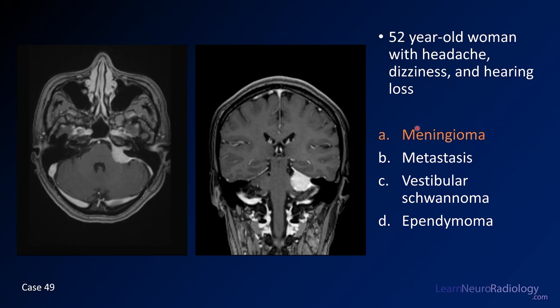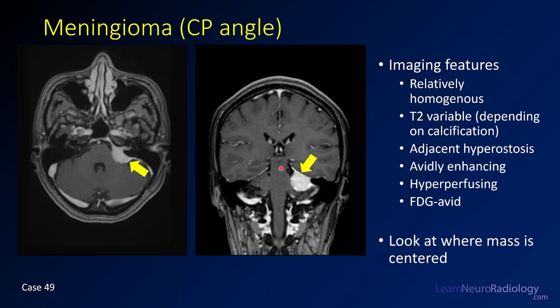This is a case of a meningioma. The mass looks centered along the tentorium or dura — it may extend into the IAC a little, but doesn't expand it and doesn't look centered there. The key rule: a CP angle mass that enhances is a schwannoma or meningioma. If it's centered in and expands the IAC, it's a schwannoma. If it's outside, it's probably a meningioma. Meningiomas can also be FDG avid or hyperperfusing.